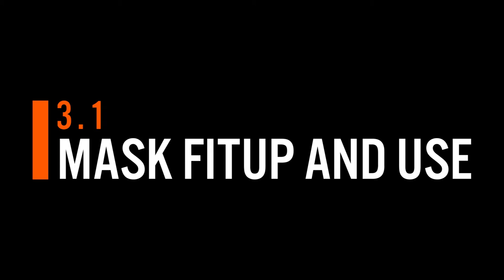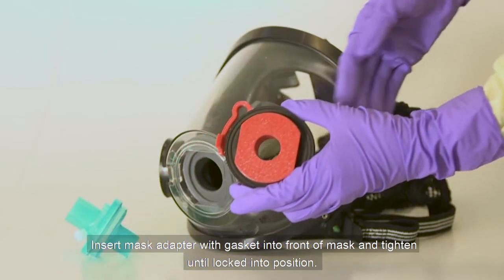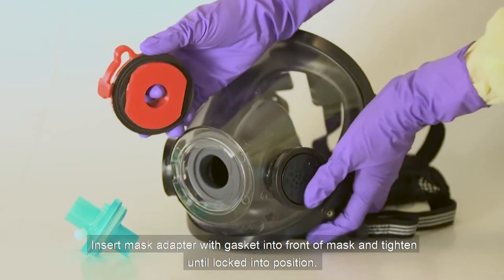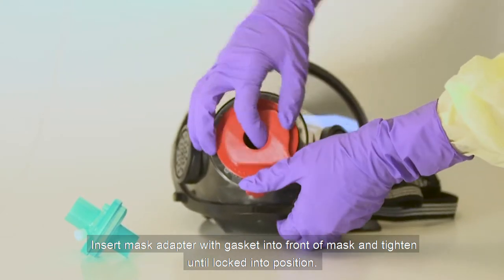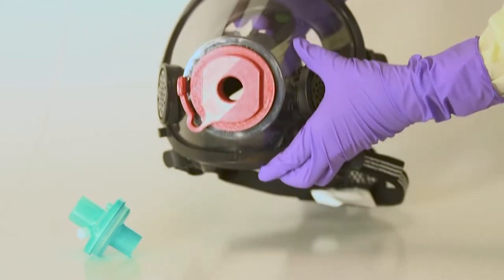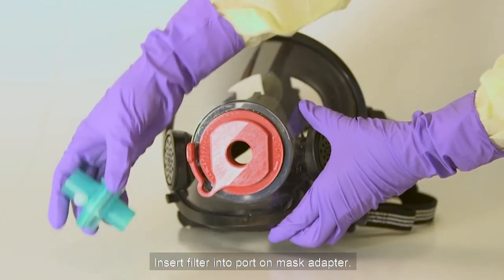Mask fit-up and use. Insert the mask adapter with gasket into the front of the mask and tighten until it is locked into position. Insert the filter into the port on the mask adapter.